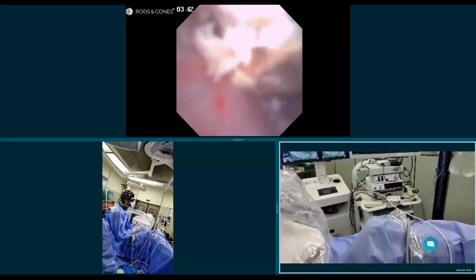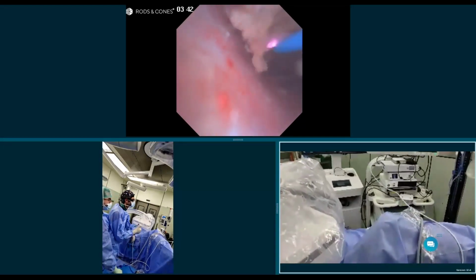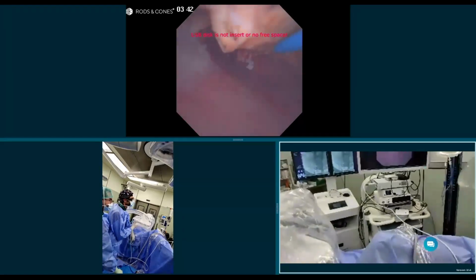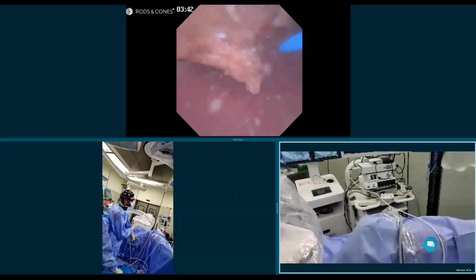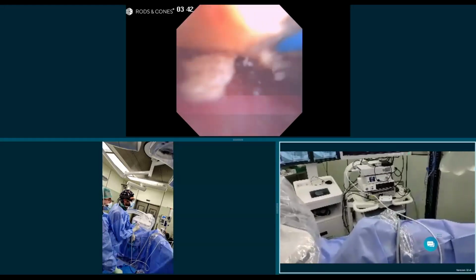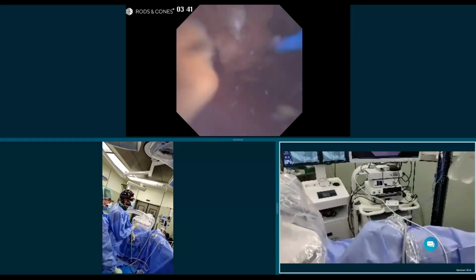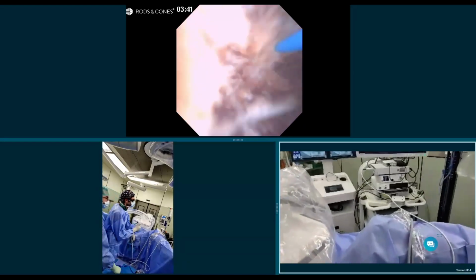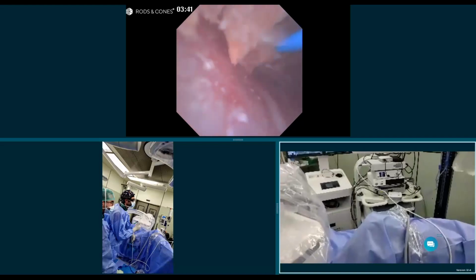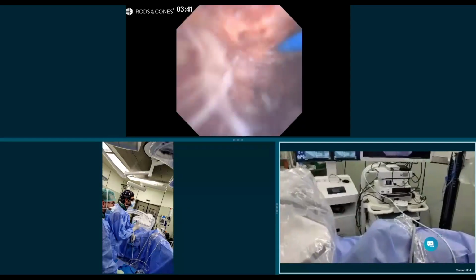So what I was saying is that you need a good laser to have a very thin dust. There's no clear definition of dust. What is commonly used is 250 microns because it's what fits on the working channel. It is the smallest particle that you can fit on a working channel that is not going to collapse this channel. So now we have a good energy with this long pulse modulation and a good frequency. I'm feeling very comfortable with the dusting of this stone.